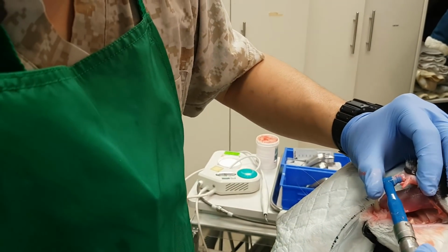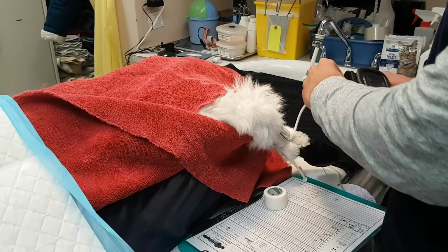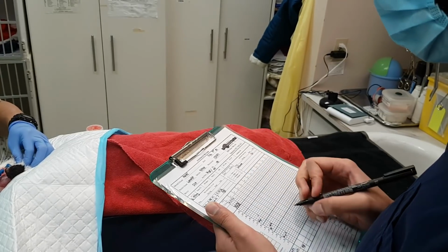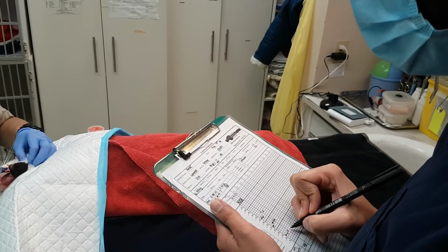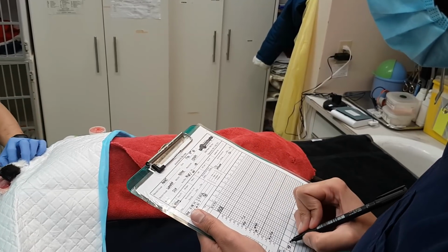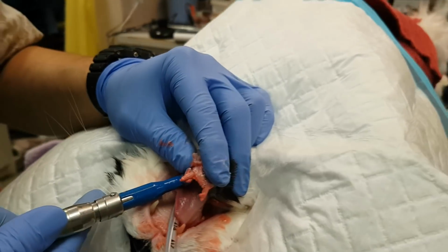By closely monitoring the patients, if we see their body is struggling with anesthetic, we can immediately make corrections or even wake them up without any permanent harm being done. As a doctor, I have a lot of tools in my toolbox to help a patient who's struggling with their anesthetic, but none of them will do any good unless we know what's happening. So monitoring is super, super important. Although ironically, one of the hardest parts of anesthesia is not messing with it when things are going well.